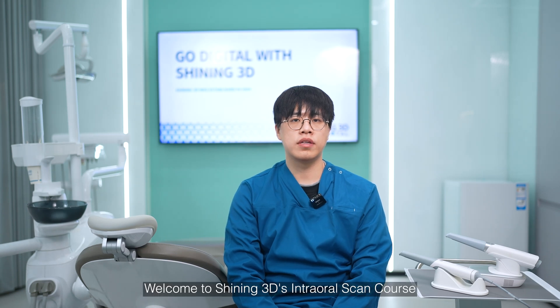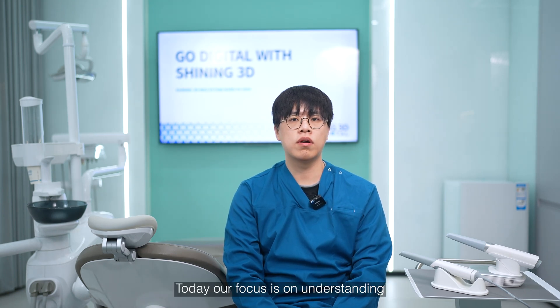Hello everyone, welcome to Shiny3D's intraoral scanner course. Today our focus is on understanding the status of your intraoral scanner.